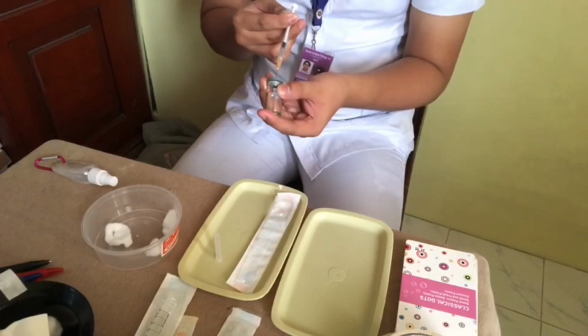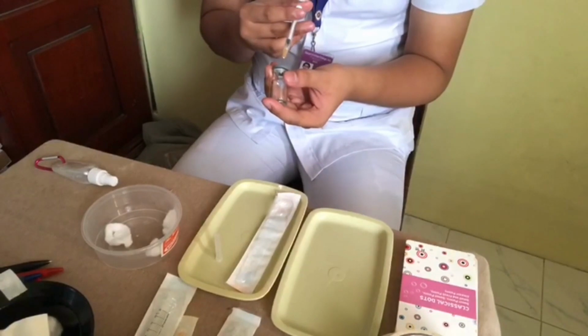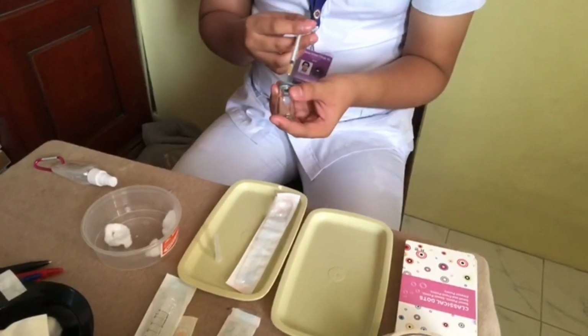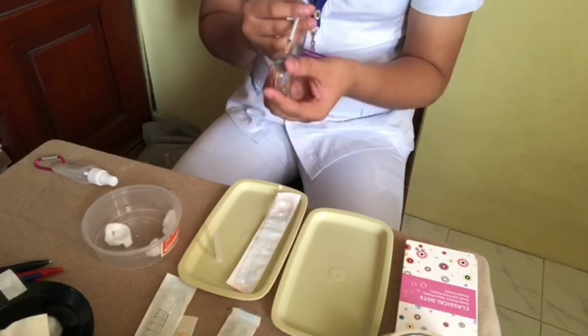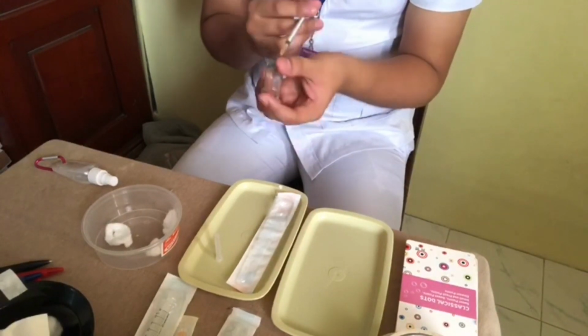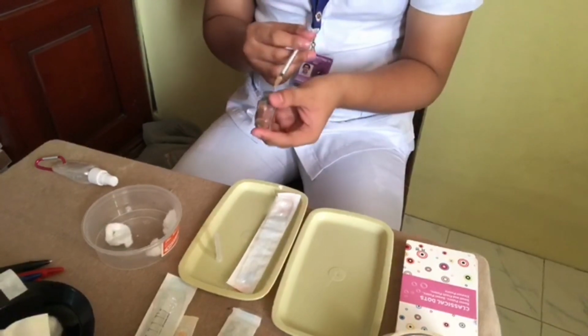I am going to inject the air. After this, we'll withdraw the prescribed amount of medication by inverting the vial and drawing the amount of the medication needed. We'll also make sure to position it at eye level so we can accurately withdraw the amount of the meds needed.